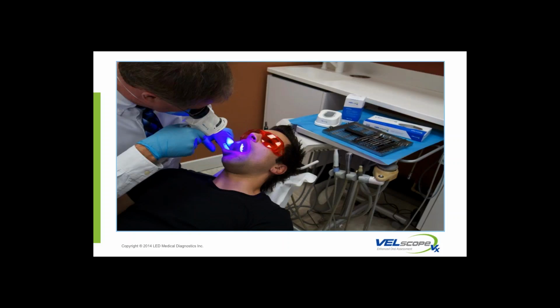Literally, you're doing your same protocols up and down, left and right, floor of the mouth, back of the throat, taking no more than a minute, minute and a half max. Here you see the clinician is holding it up to his eye. You can actually, though, do an exam wearing your loops. It's pretty straightforward, and we'll show you the pictures.